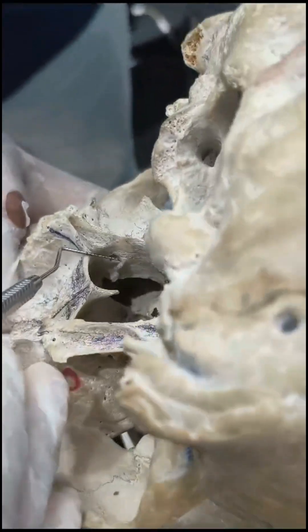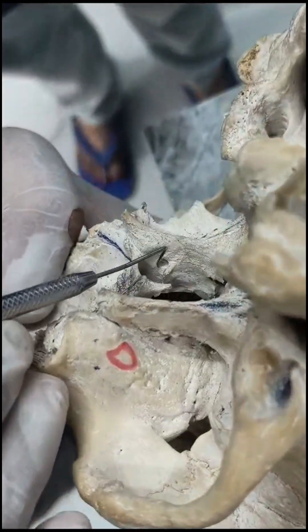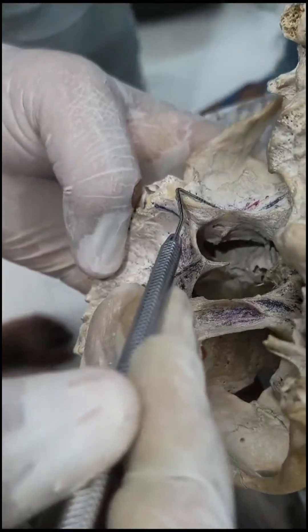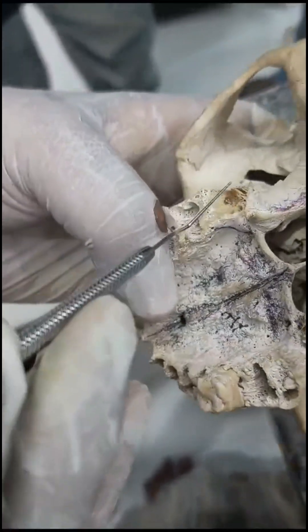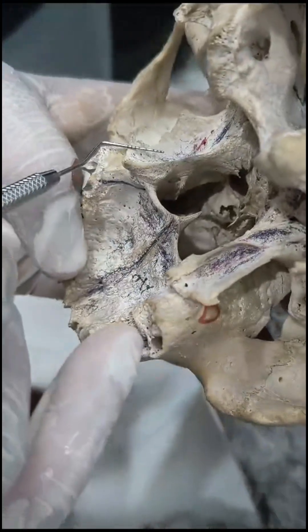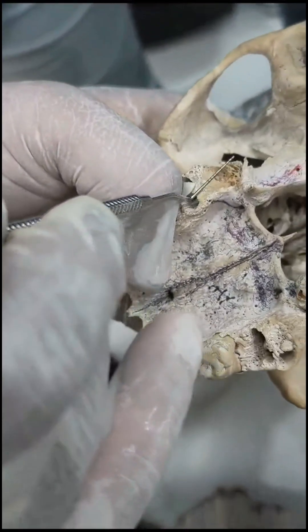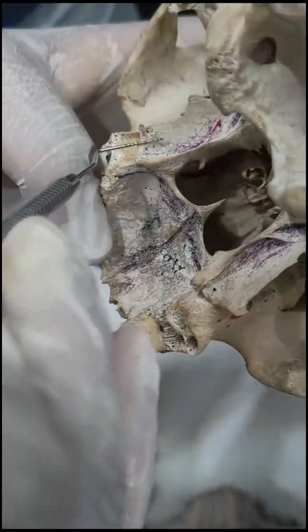This is very tricky because the descending palatine artery is coming down right here and we are engaging the implant — so we are very close to it. Care has to be taken not to angulate the implant excessively while going upwards. If we tilt our drill 10 to 15 degrees, we are within the safe margins.